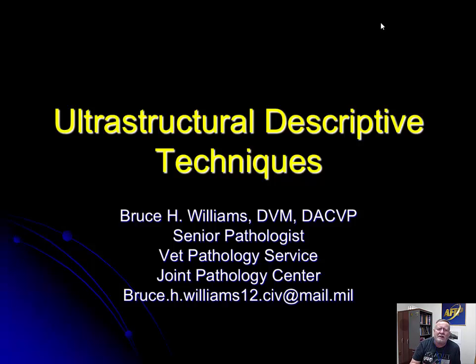So this lecture is sort of focused on descriptive techniques, but I think there's a tremendous amount of good basic general ultrastructure information in it. It's not going to make you the world's best ultrastructural pathologist, but I'm hoping it will give you a little more comfort and confidence when you come across photomicrographs of electron microscopic sections, and you'll realize it really isn't that much different than what we see on the microscope.